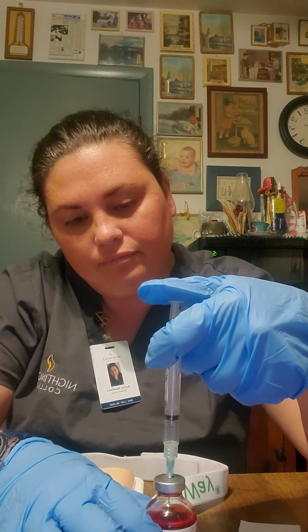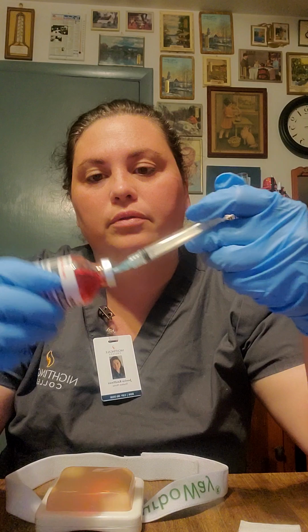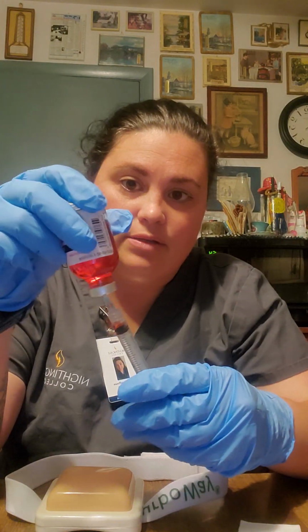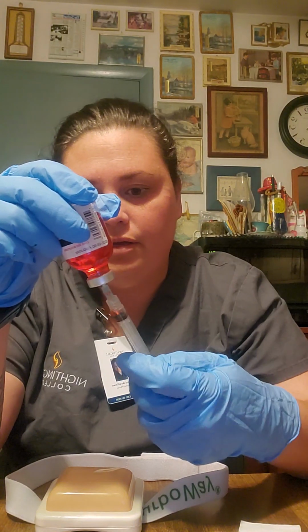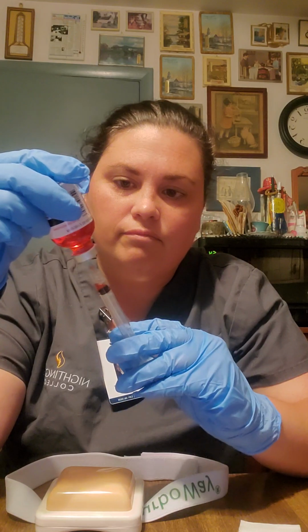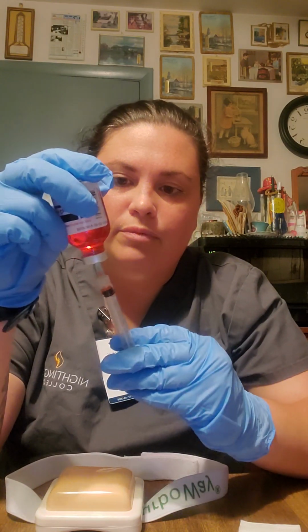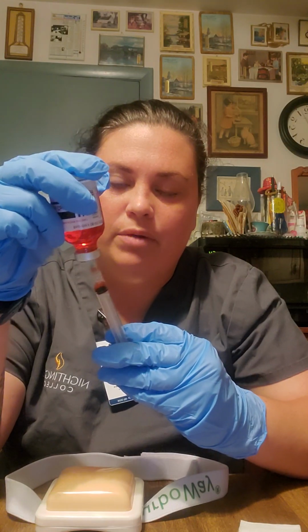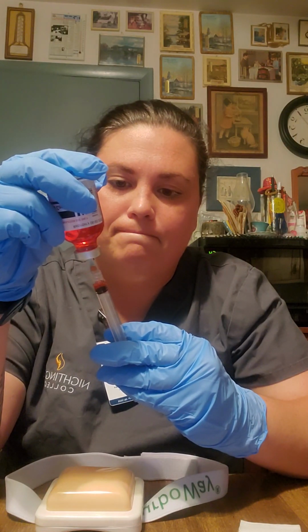Okay, I'm going to flip to invert, making sure that my needle is definitely into my solution. Pushing back up if there's any air bubbles, and I would be withdrawing slowly.